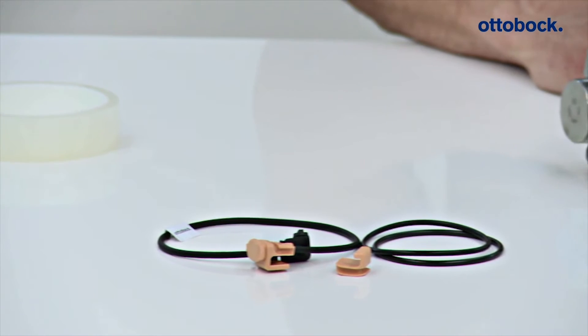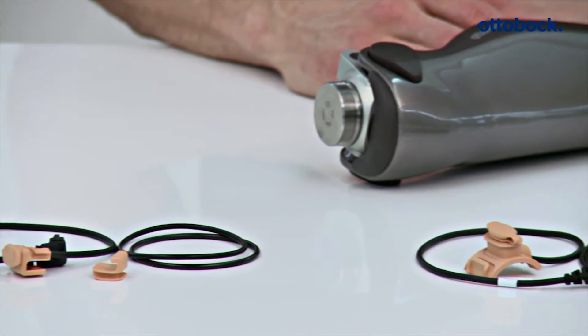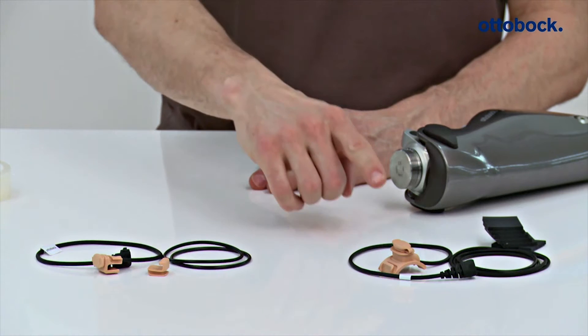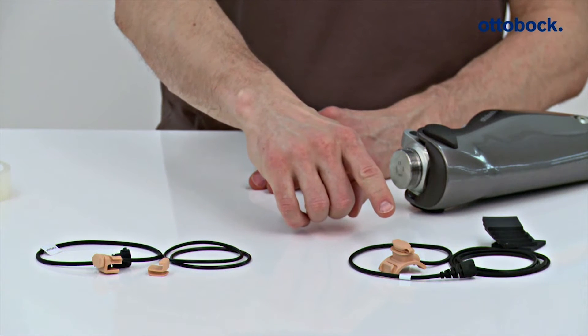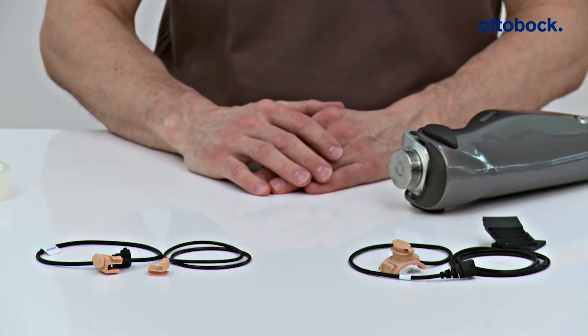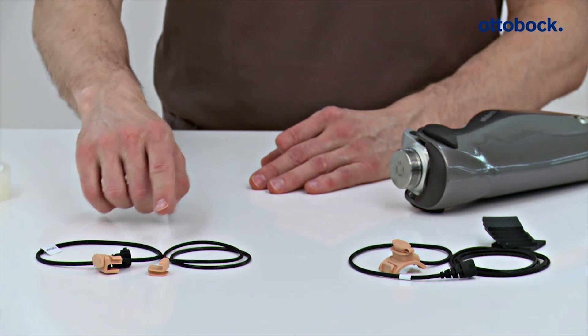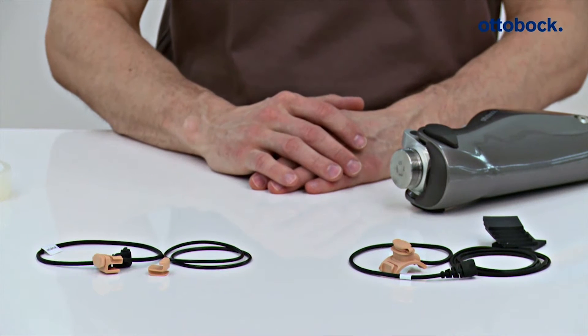In certain cases, it may make sense to attach the charging receptacle of the CLEG4 prosthetic knee joint at the ankle or knee area. If an extension to the ankle is required, the 4X156 charger extension cable can be used for this purpose. The product 4X157 can be used to extend the charger cable to the top of the knee.